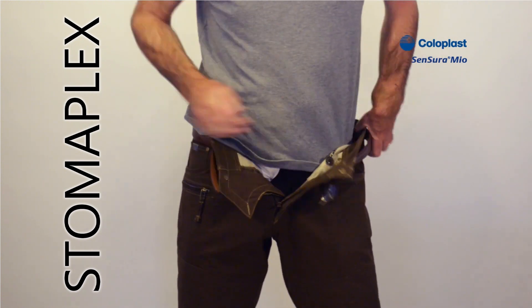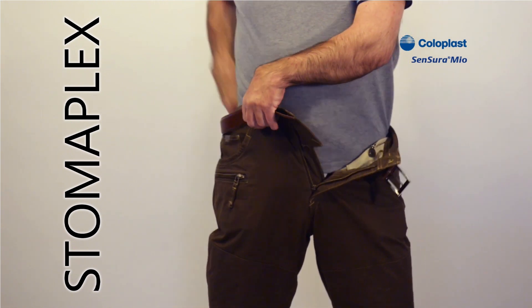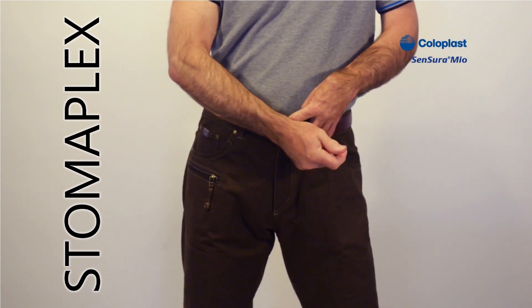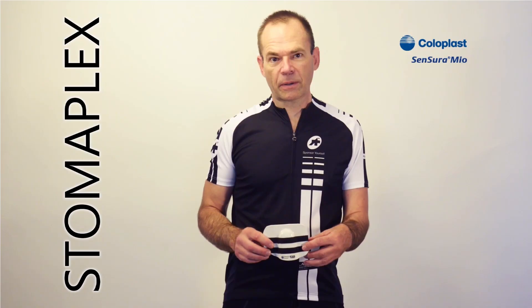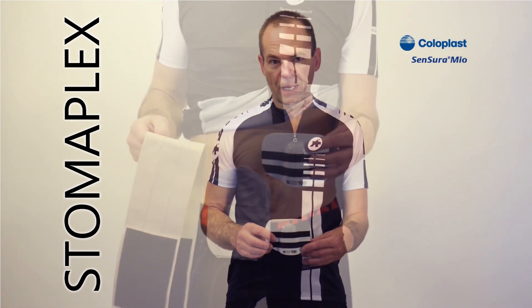Now we can just finish getting dressed. It really helps when you have to wear a belt. I can really pull this belt tighter than I would normally pull it, just for this demonstration. The guard is going to protect me from the clothing and from those accidents if they would ever happen.